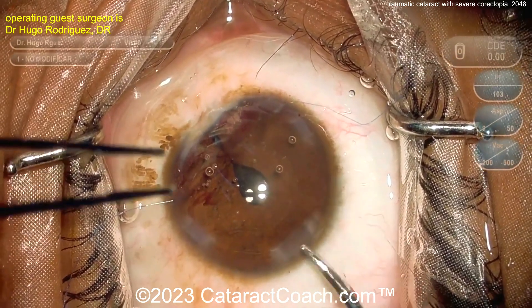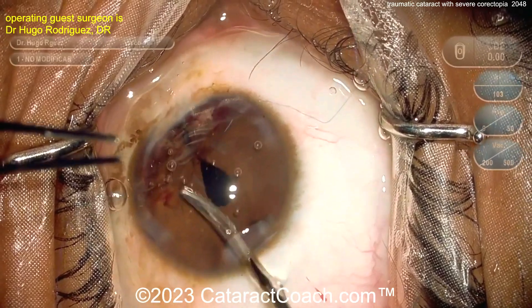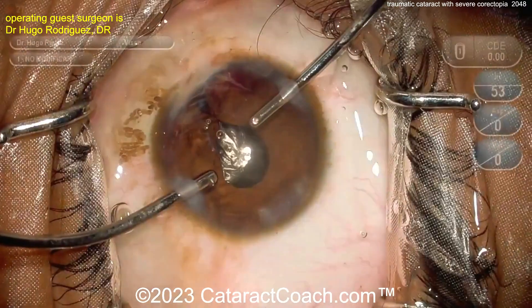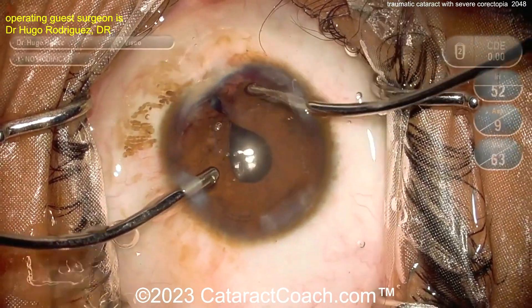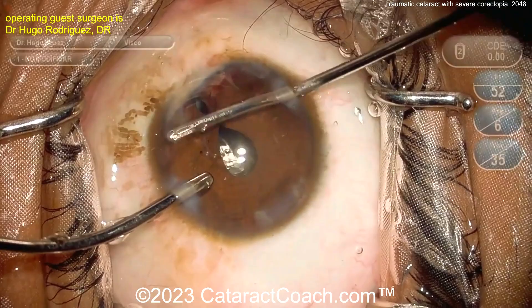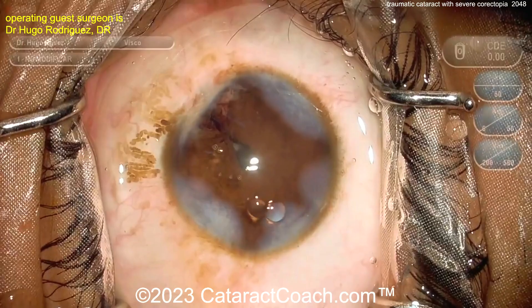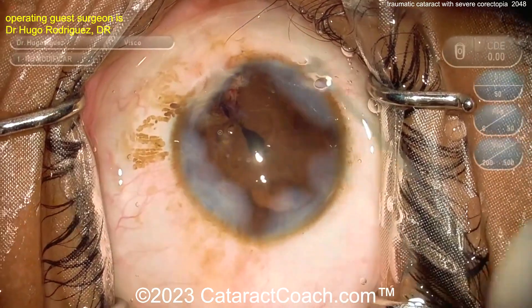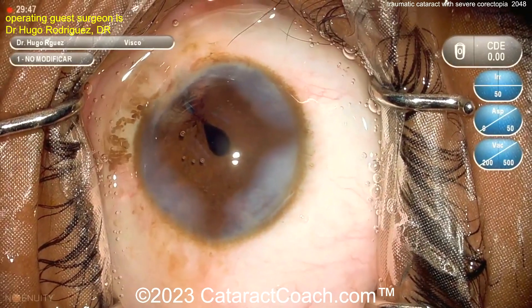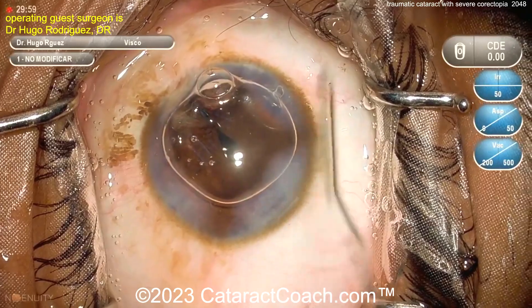In a case like this you may also need to make a small incision on the opposite side of the iris to allow it to open up a bit more. This pupilloplasty helps give the patient a better cosmetic effect and better vision, since the patient can now look through the center of the optic. Additional sutures can be placed to close any remaining defects. At the end of the case the result is really very nice — well-centered — and the patient improved from counting fingers pre-op to approximately 20/40 vision post-op. Great video and great case.